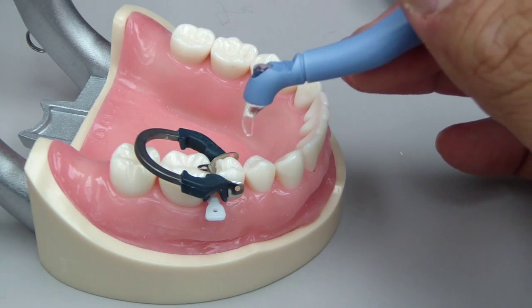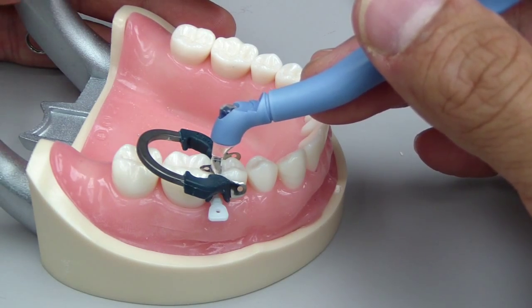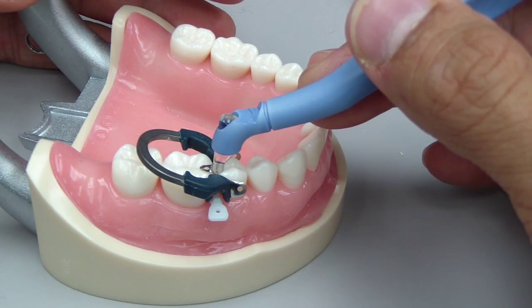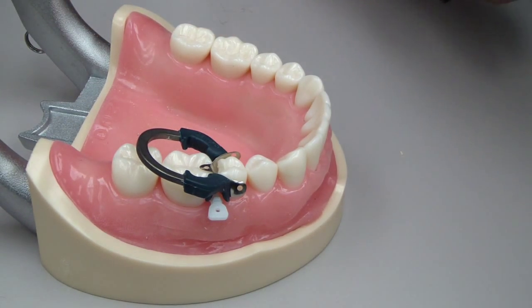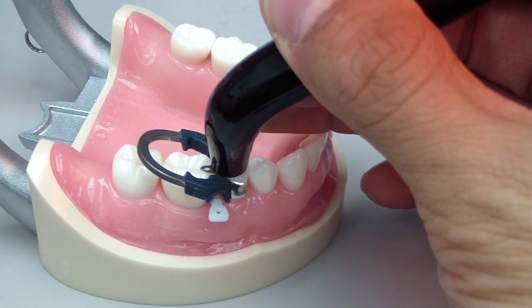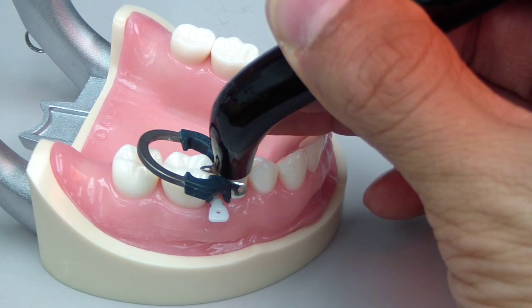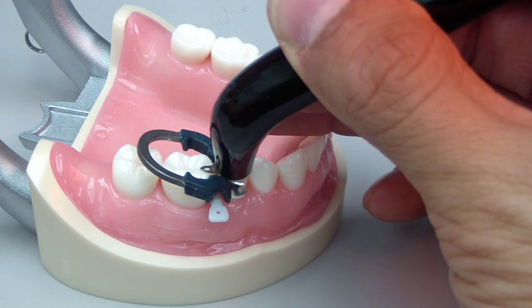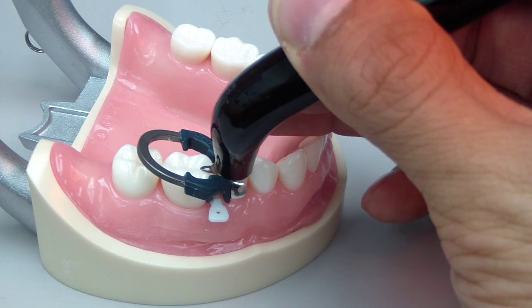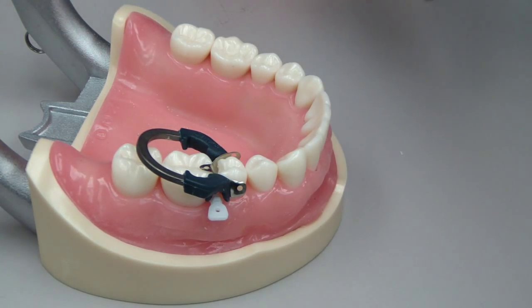What would probably be a recommendation — fairly common sense — would be: after you cure through this, you'll have some curing. Remove it, and then use your curing light without it and cure for the appropriate amount of time required by your light type, your composite type, and the shade of composite — all those factors will affect the required curing duration.